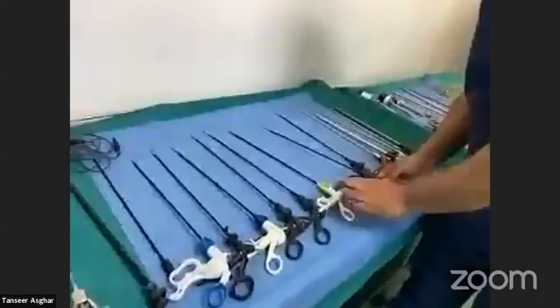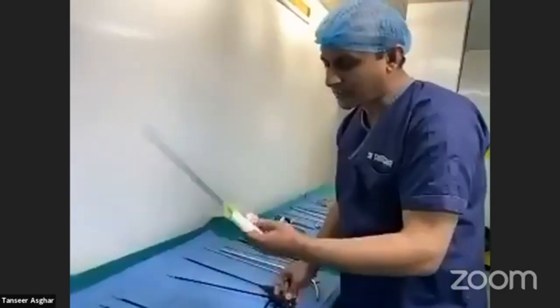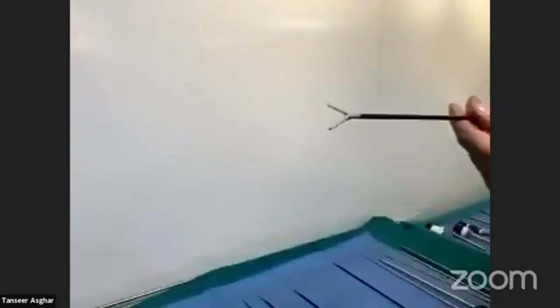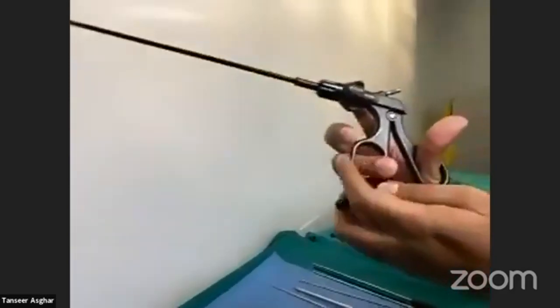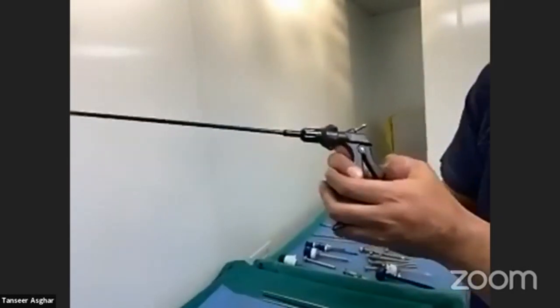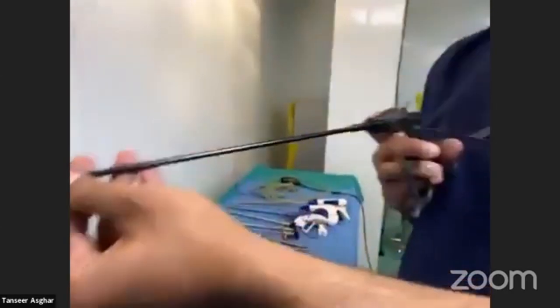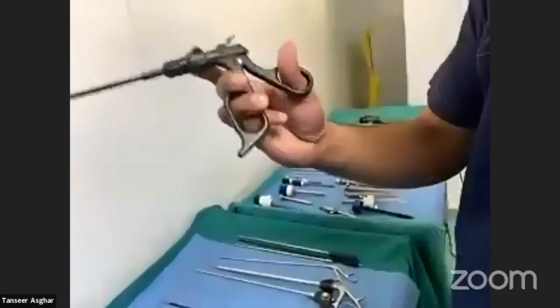In laparoscopic instruments there are also reusable instruments which can be sterilized, as well as disposable instruments used once and discarded. Here you can see a double-action atraumatic grasper with no lock. You can easily hold the bowel during appendectomy or any other intra-abdominal laparoscopic procedure. It also has an attachment point for cautery and a rotating knob on the handle.